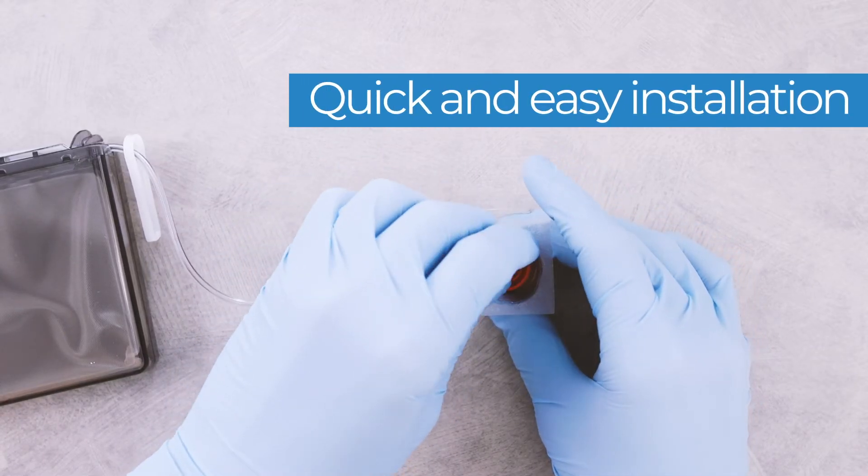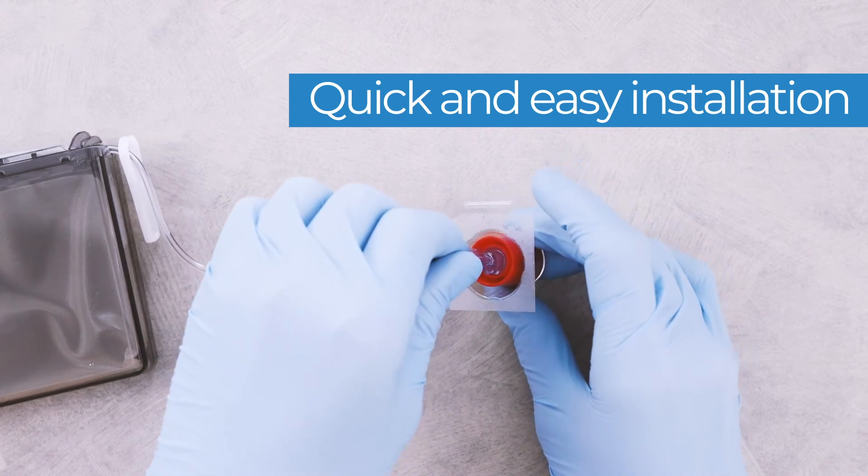To install, simply insert the female Lure connector into the cap and rotate clockwise.